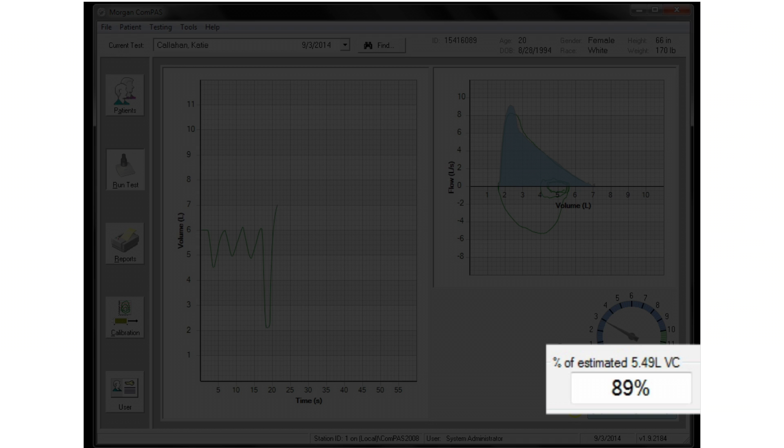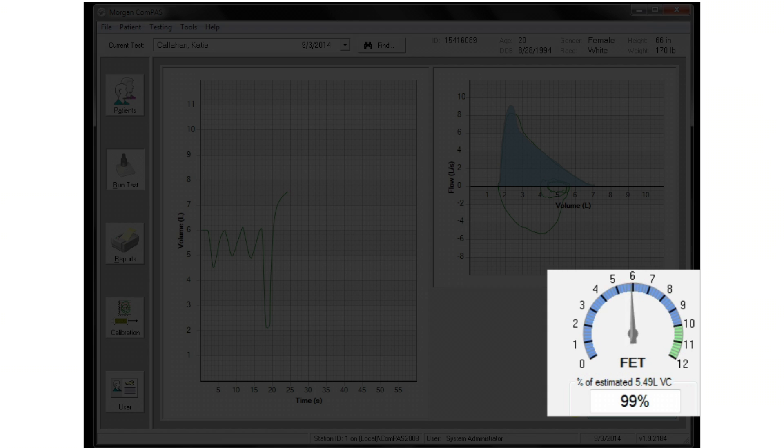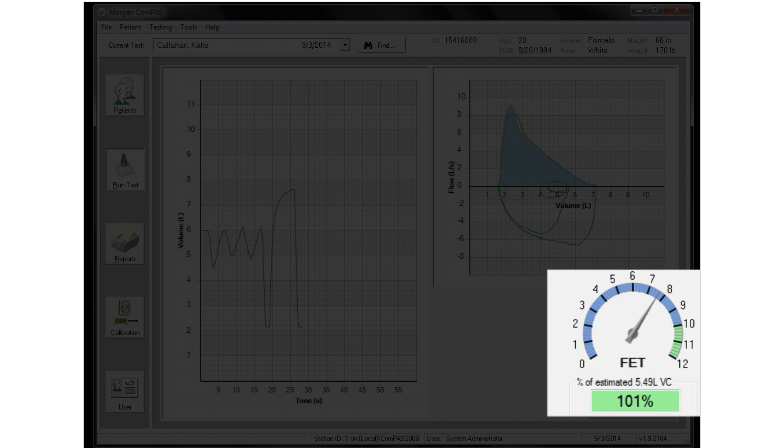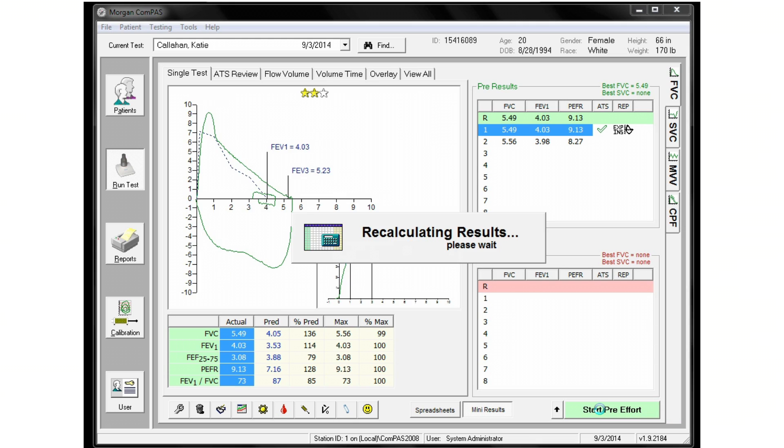When this climbs beyond 95% and the FET meter is past six seconds, most efforts will meet ATS acceptability.